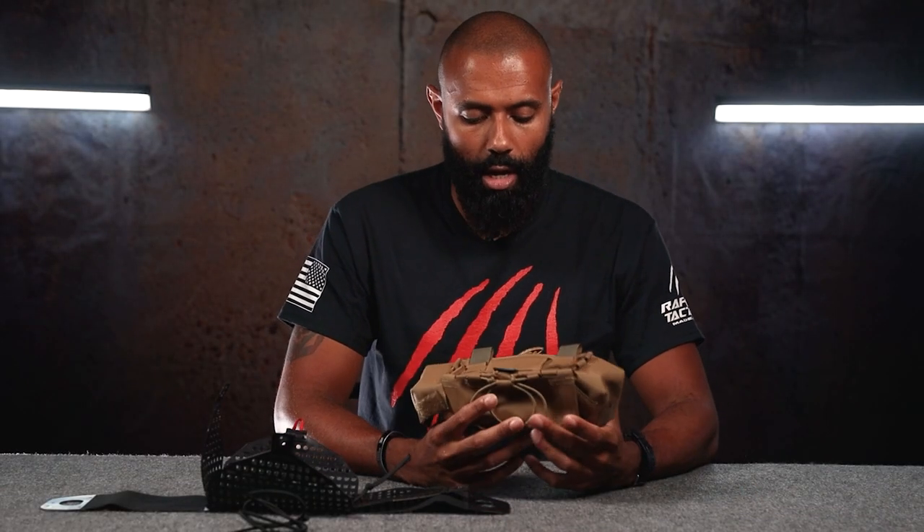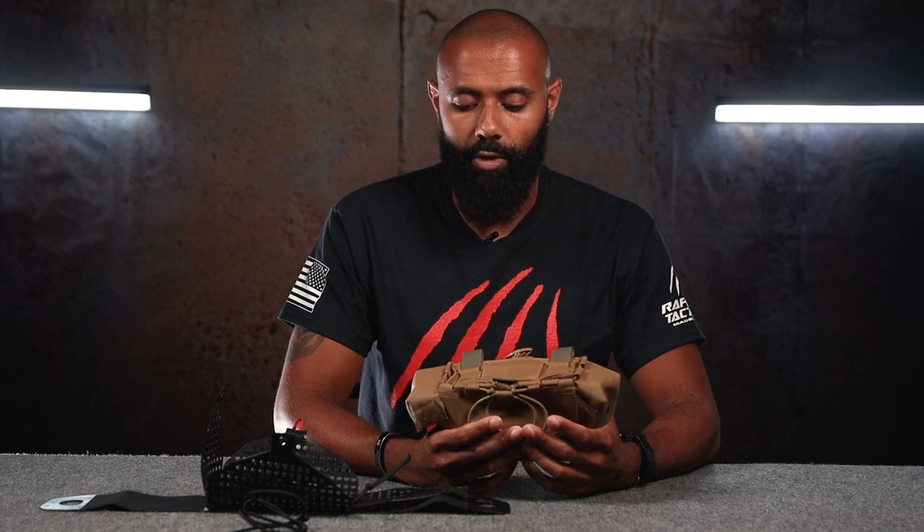Welcome back, folks. Cam with Raptor Tactical here today to talk to you about the Raptor Tactical MIFAC system. The MIFAC system is our approach to an IFAC. We're just going to go ahead and go over the features.